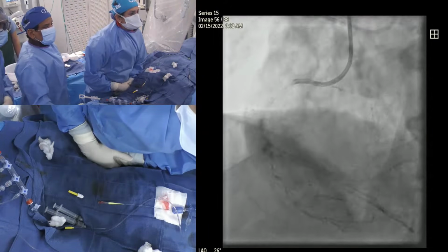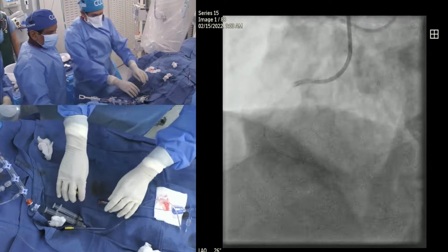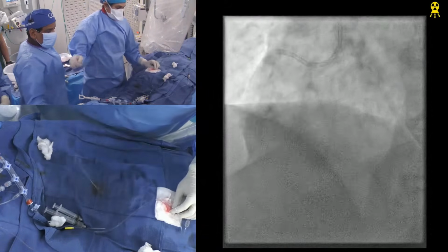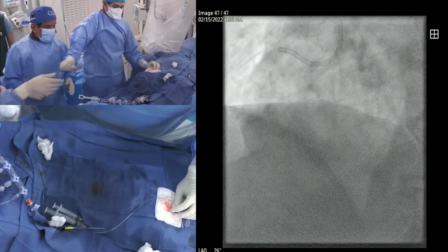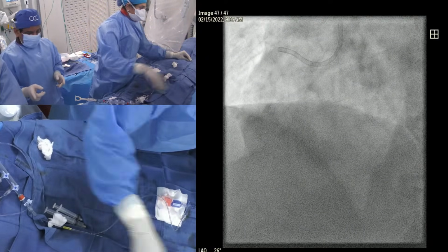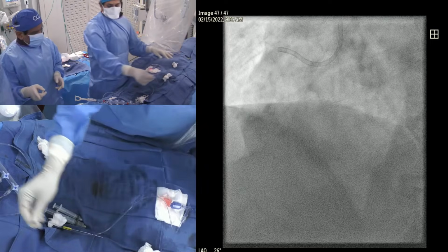I think that's enough for the vessel. Okay. Now you want to go to the other side itself? Yeah, we have it there. Go with the VL. We have the Corsair, but we need a different Corsair. Yeah, we have 150.